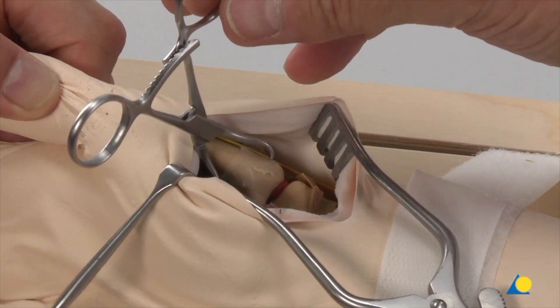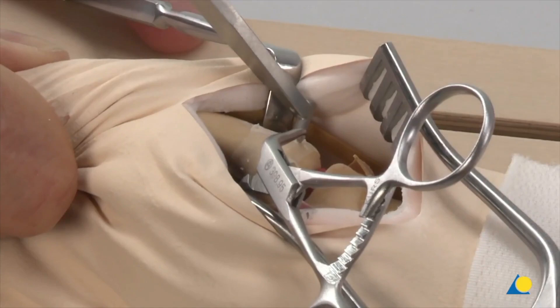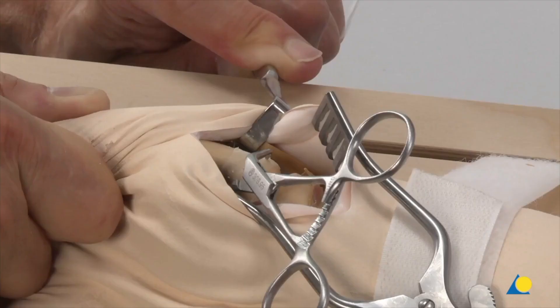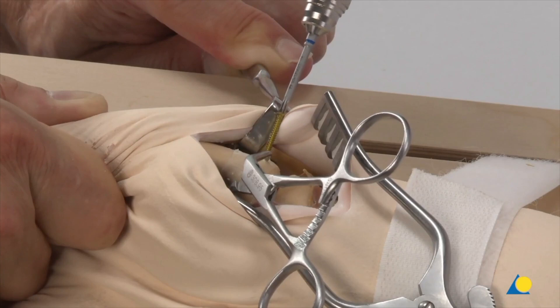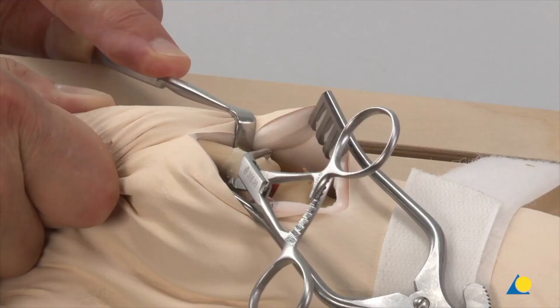The 1.5 mm drill guide is inserted into the first gliding hole. The 1.5 mm thread hole is drilled along the same axis into the Bennett fragment. The depth is measured, and a self-tapping 2.0 mm screw is inserted as a lag screw; however, the screw is not completely tightened at this stage. The second lag screw is inserted in the second gliding hole. Because of the cancellous bone structure here, countersinking is not necessary.